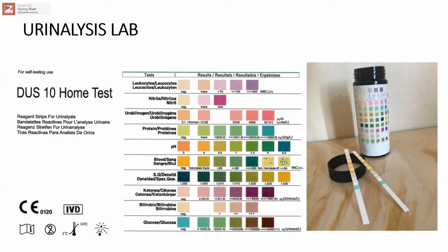So urinalysis is a very simple, straightforward test, and if there's any abnormality seen in the urine, they perform further biochemical tests or further radiological tests to check for any pathological condition. Normally, we excrete about 1 to 1.8 liters of urine in a 24-hour period, and the test can be performed by using dipsticks. So these, let me look for the pointer.